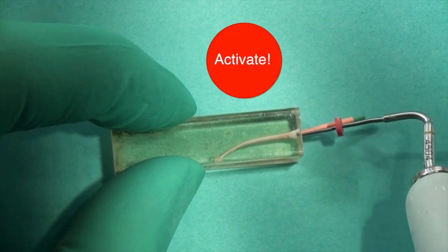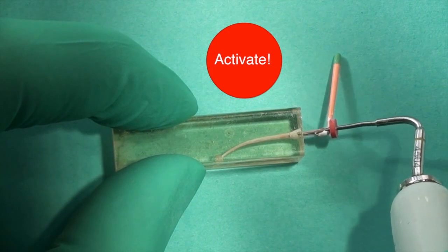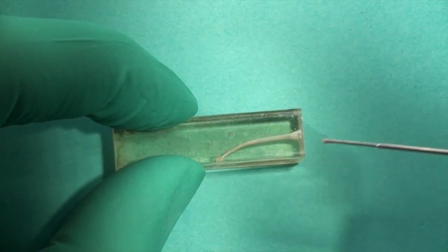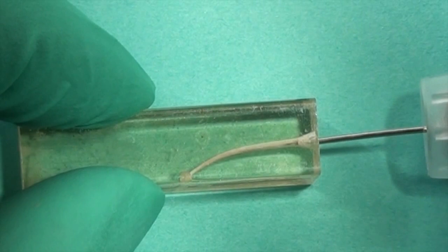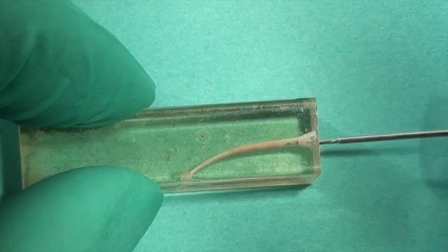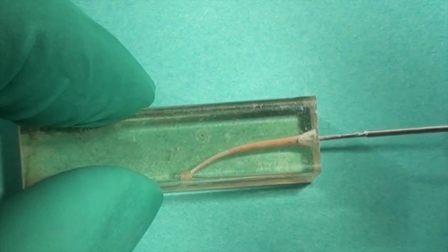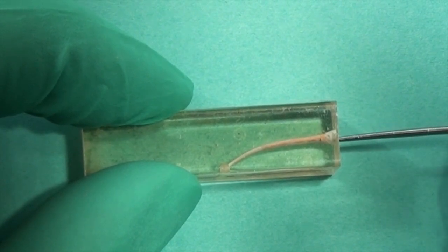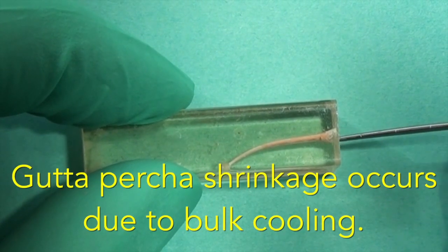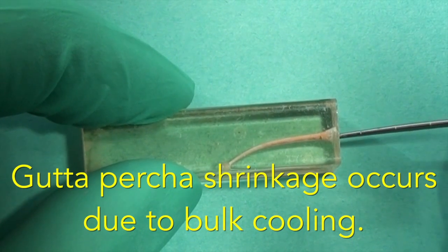Using the pre-fitted fine tip and going through the cone in one single motion, you can see how easily the EndoPro 270 heat source works. Now I'm using BC pellets with an Optura gun at 150 degrees, backfilling by getting the tip all the way down to the base of the preparation. I'm filling the whole preparation in one shot — however, as Dr. Schilder described, you're supposed to use two or three millimeter aliquots followed by condensation. It seems nowadays everybody's doing a workaround and filling in one shot, which we'll discuss, because I think that's actually not ideal.